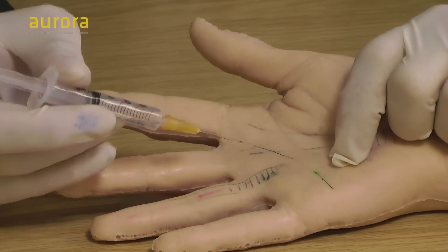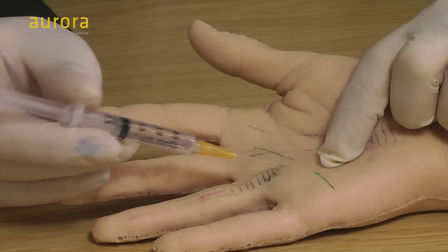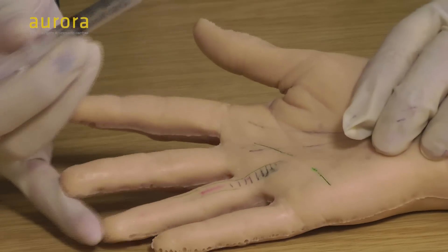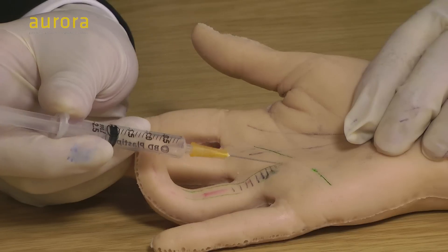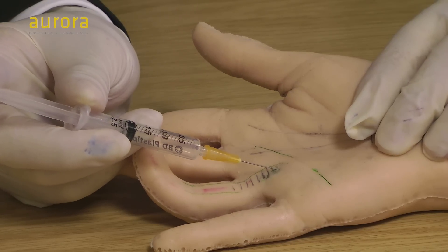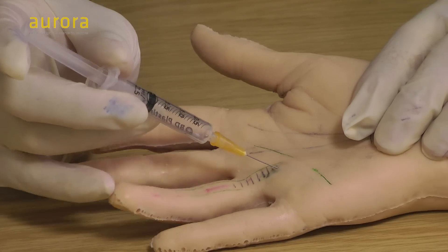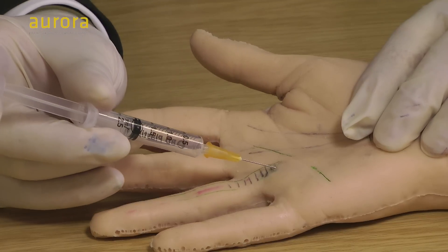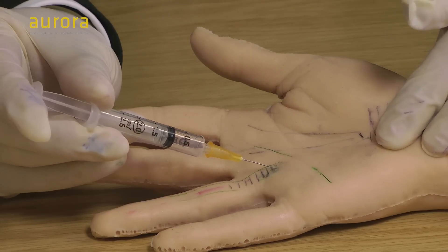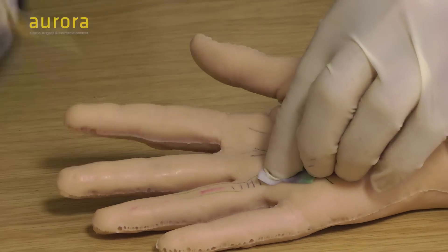Put your finger on it to locate the spot, then with the numbers of the syringe up and the bevel of the needle up, just pop through — ideally with the finger slightly bent. Pop through the skin, through the subcutaneous tissue, down onto the top of the tendon. Now you might actually be on the tendon there, so if you ask the patient to straighten their finger, that pulls the tendon away and you should be able to inject really easily. If there's any resistance, stop — you should be able to inject really easily into that sheath.